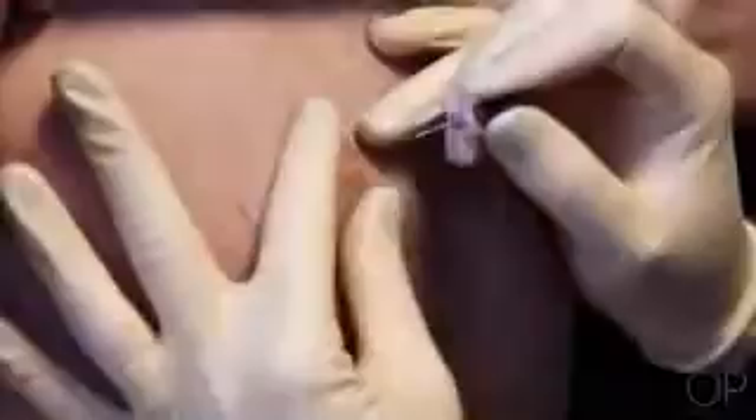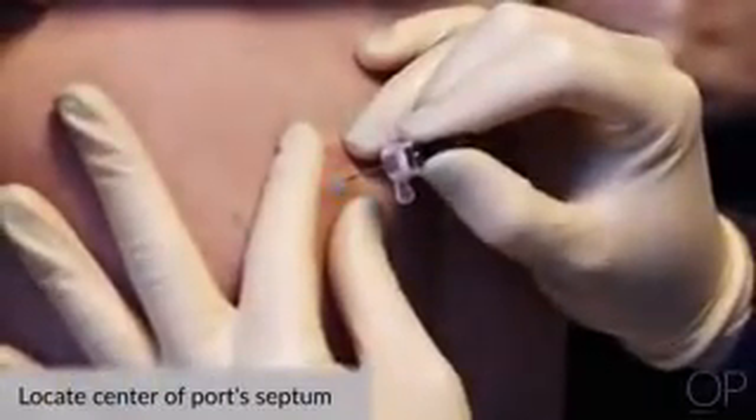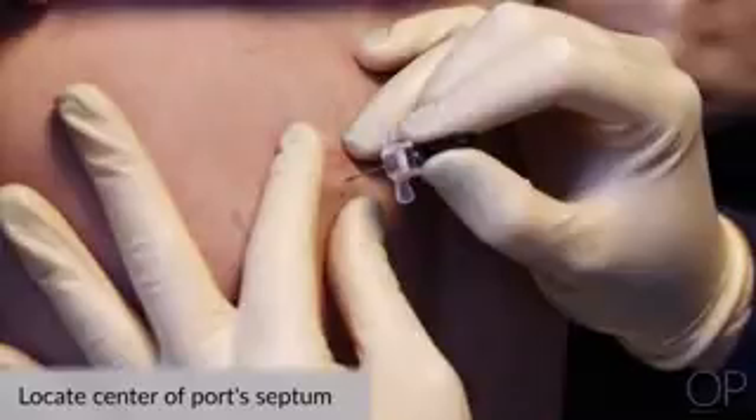Palpate the area of the implanted port with your non-dominant hand, locating the center of the port's septum. Rotate the site with each access. Do not use the same hole for each access as it will lead to skin breakdown.